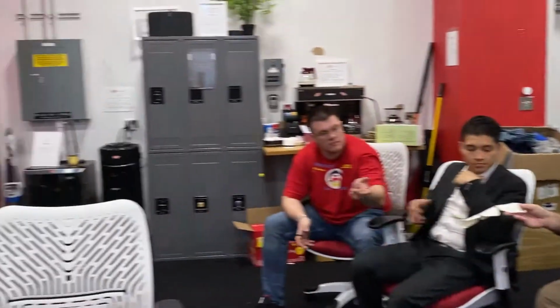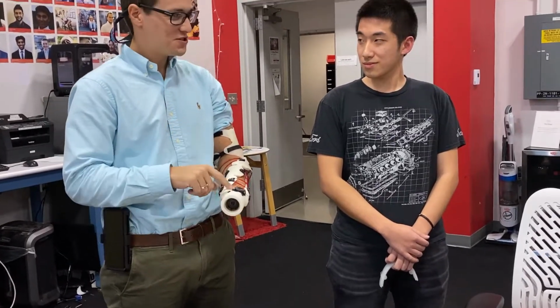So I'm seeing what look to me like two wonderful innovations. One is the notion of a flexible framework which will optimize the sensors. But the other is just the socket itself, which looks like it's pretty conformant, it's adjustable, and it allows a great deal of manipulation. What software did you use? What did you make this in?